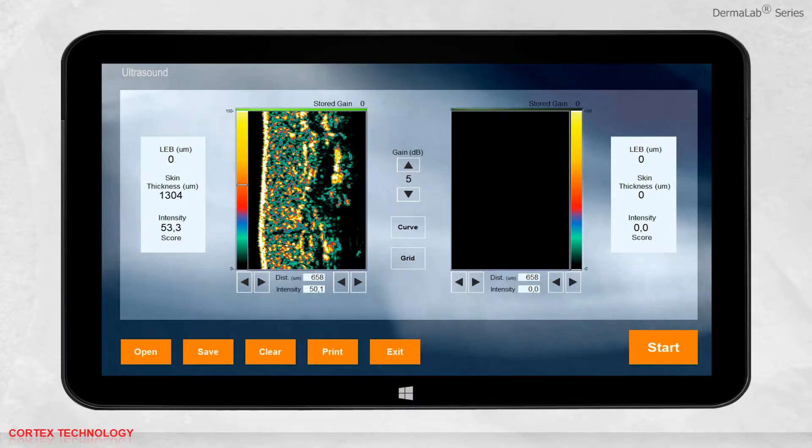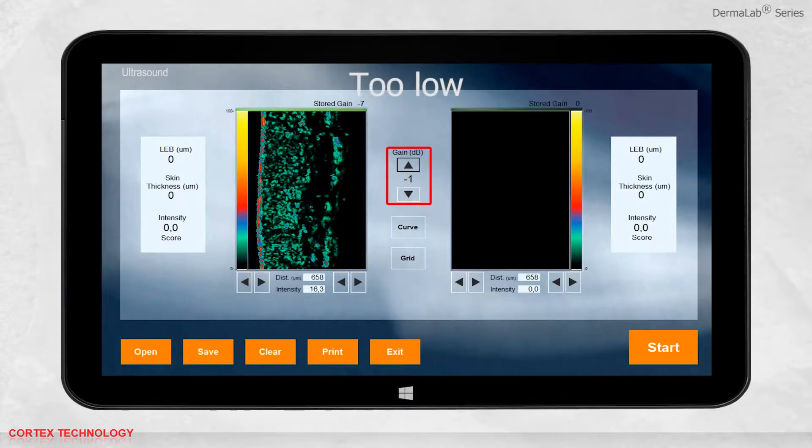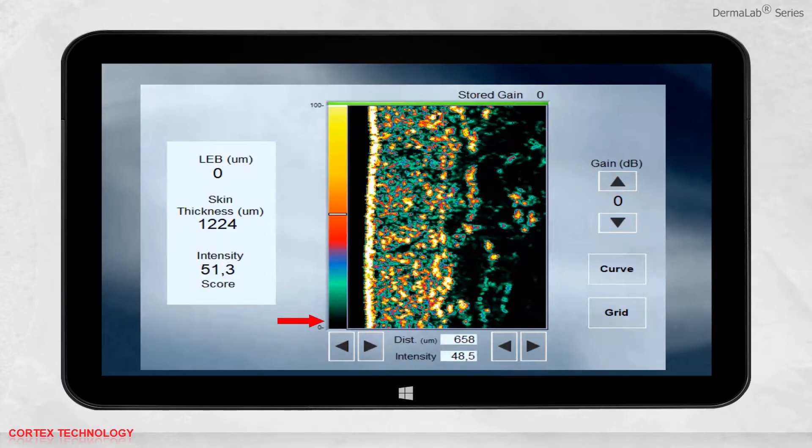To obtain a good image, it is important to select the correct gain setting, which will depend on the skin properties. In the ultrasound image, colors represent the reflection strength of the ultrasound signal. Dark colors represent low-level reflection and lighter colors represent stronger reflection. The white colors of the epidermis indicate strong reflection, whereas the mix of many colors in the dermis visualizes varied tissue composition.